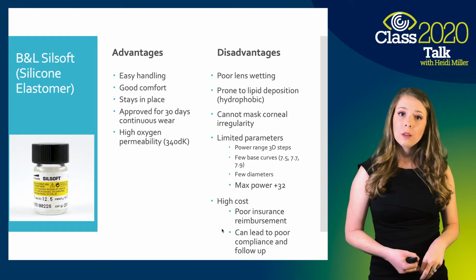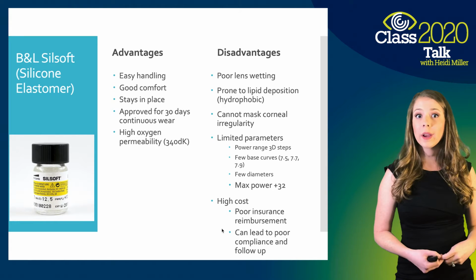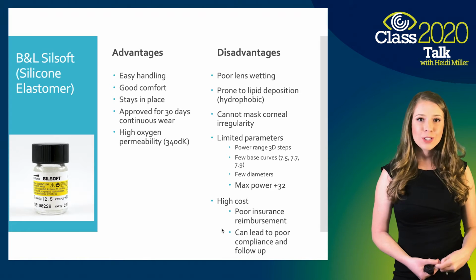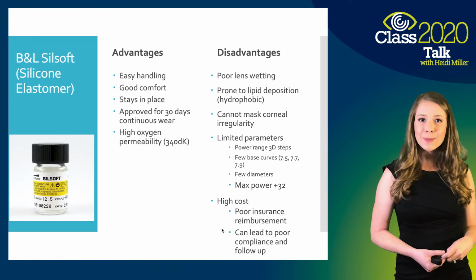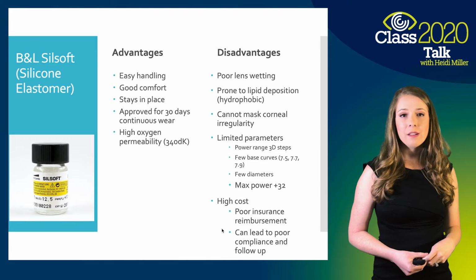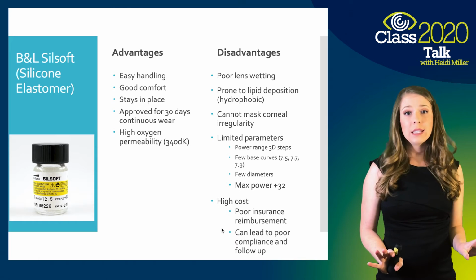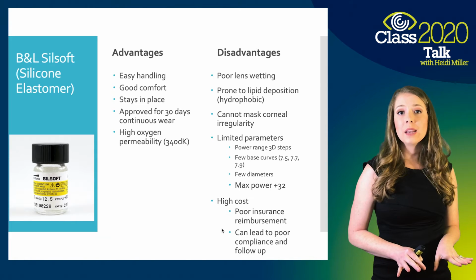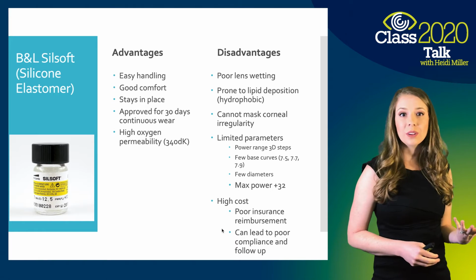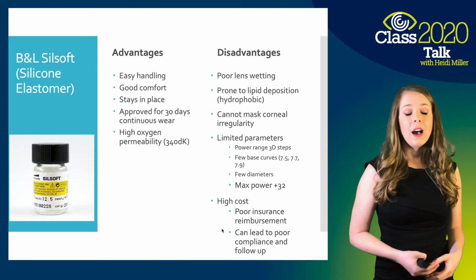And I think that's really important. I don't usually promote extended wear or continuous wear with my patients in contact lenses. However, you will come to know when you're working with babies, sometimes they don't cooperate and sometimes they're fussy and it's hard to get the lens out. And so there may be times when a mom is just saying, I can't do this anymore today, and the baby's going to end up sleeping in that lens. And it's kind of peace of mind to know at least that this lens is approved for 30 days continuous wear, because that is potentially going to happen.